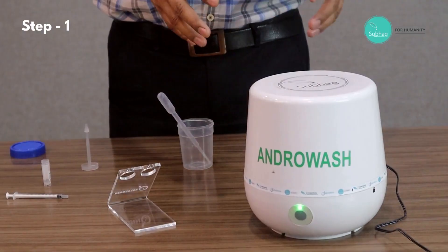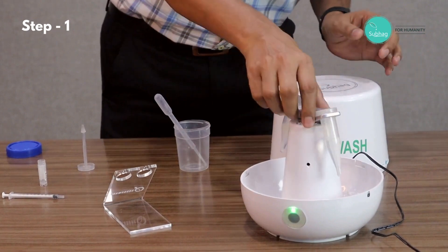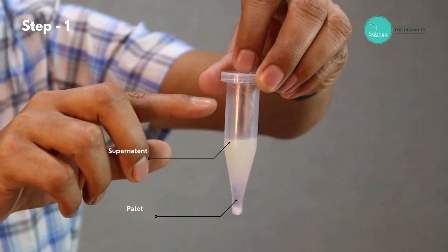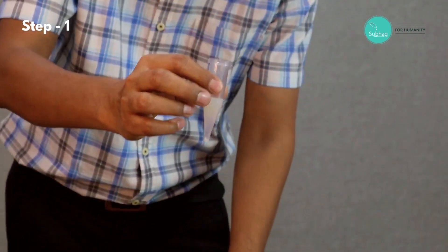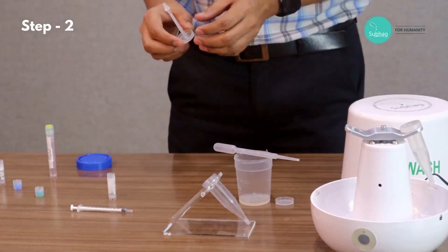Now we press start and the machine has started. It will automatically run for 10 minutes and after that it will stop. The 10 minutes is over and the machine has stopped. We open it and take the tube out. As you can see, the pellet is already visible at the bottom and the supernatant is over the top. To discard the supernatant, we remove the cap and simply tilt it so all the supernatant is gone.